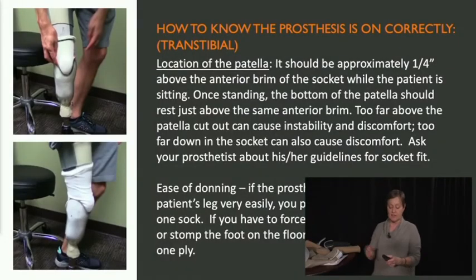So those are a couple of different ways that I can tell generally if they're in the right place in the socket. And then, of course, taking off the liner. Do you have any red spots? I touch all the bony prominences, anything sore. That's another way to double check.